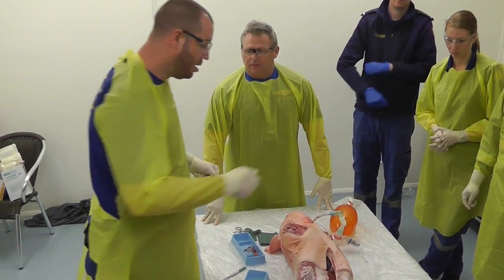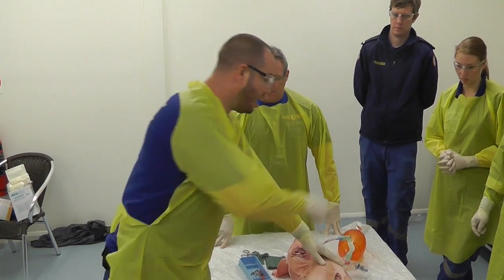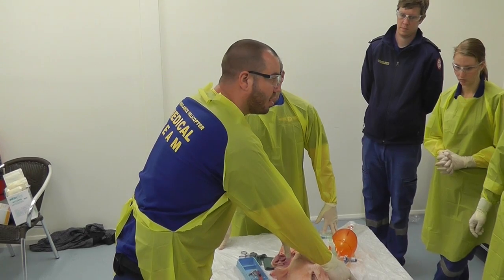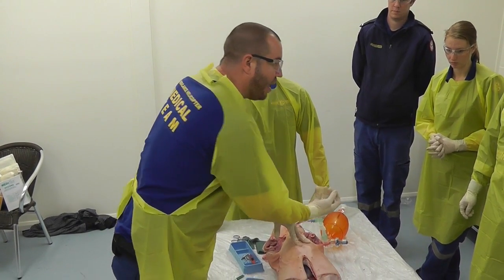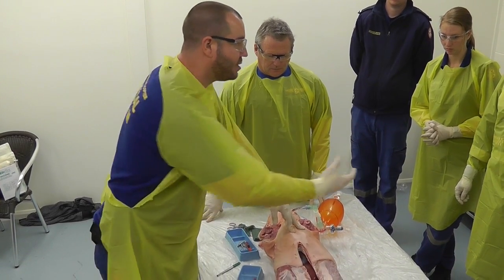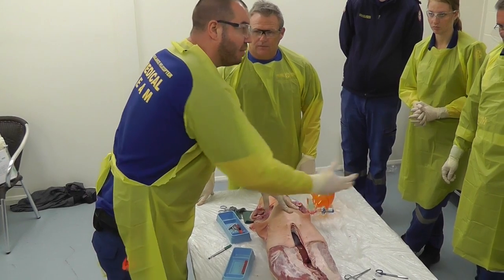Often as a physician — in fact every time as a physician — remember about a surgical airway. Your physician position is going to be in the left axilla because that is the money shot. Your assistant is going to be on the other side. When you scoop that blood out, have a think about where you are going to put it — put it out of the way, on yourself or your colleagues' shoes, because there might be half the patient's blood volume in that side of the chest.